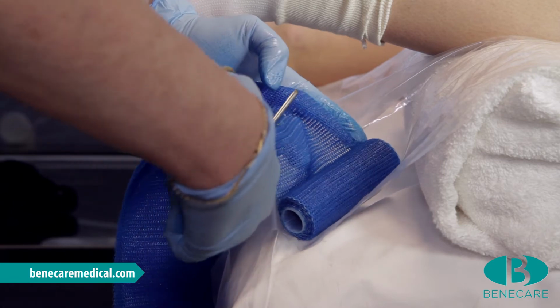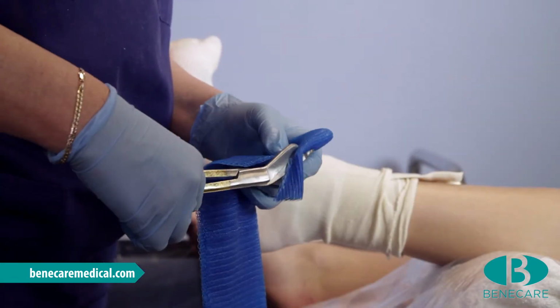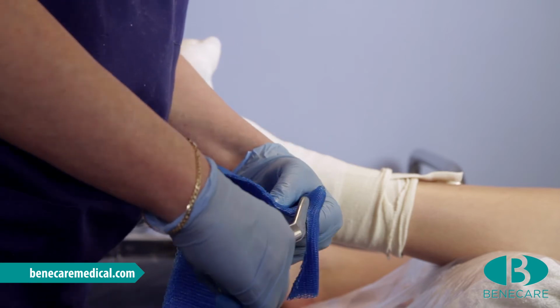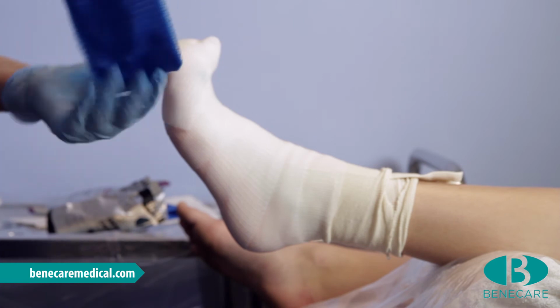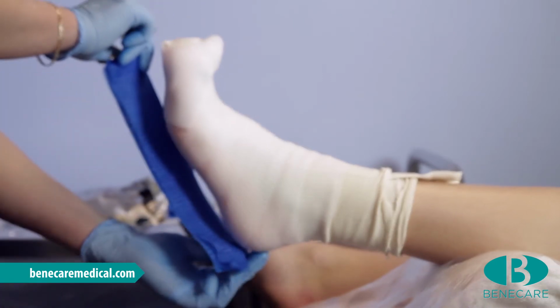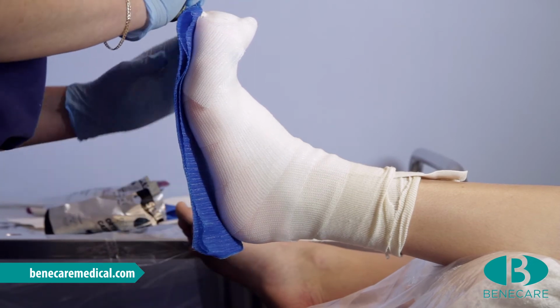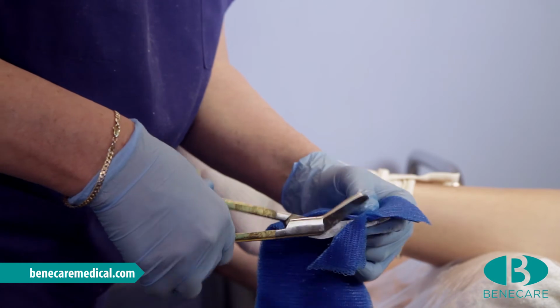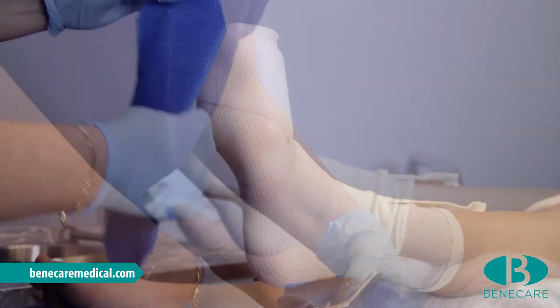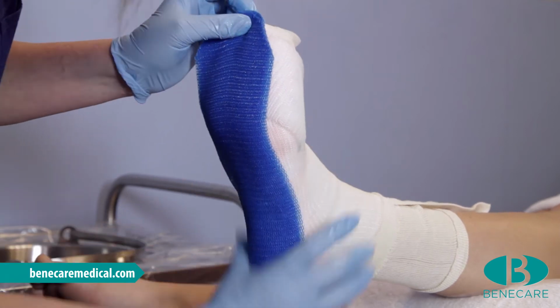Cut from the roll and trim, rounding one end. Then measure from the apex of the calcaneum to the toes. I will now trim the distal end of the slab to the shape of the foot. Position the slab of the plantar aspect of the foot and mould well.